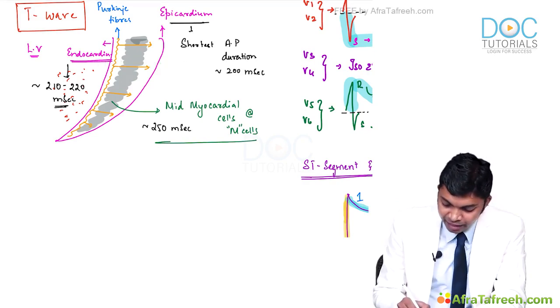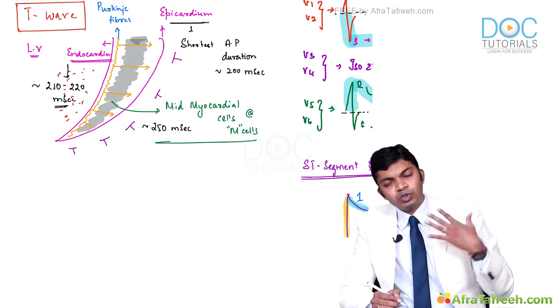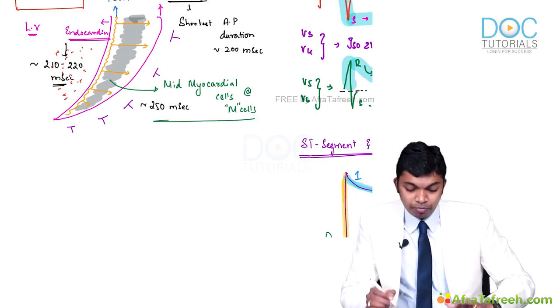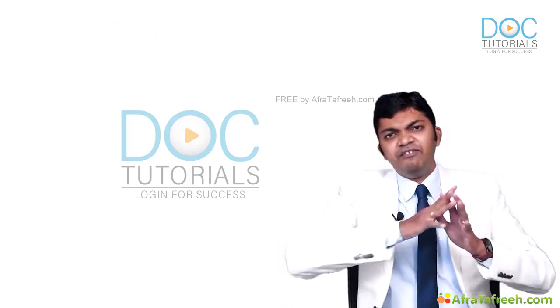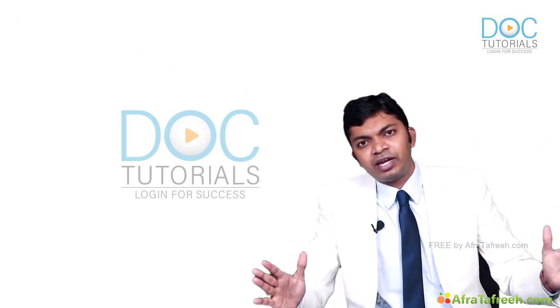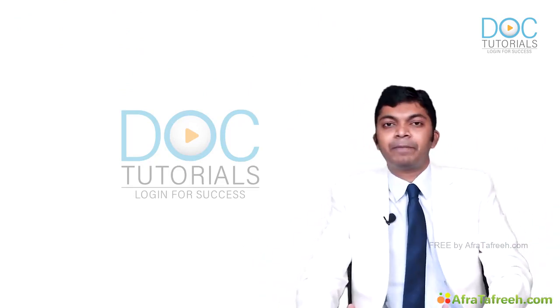Okay, so we have active electrodes V5, V6 or any other active electrodes V1, V2, everything is kept close to the epicardial surface of the ventricles, isn't it, doctors? Now, please be very clear here. As the action potential of every single ventricle is happening till 200 milliseconds, every ventricular myocyte will be in a state of depolarization, right?